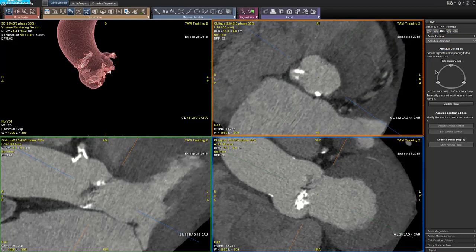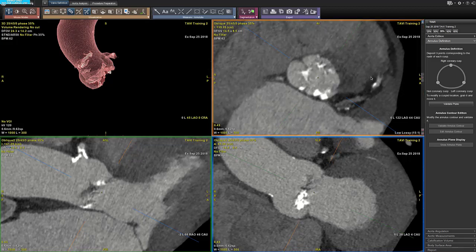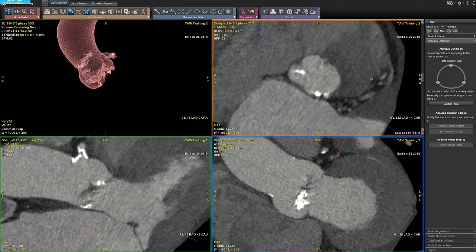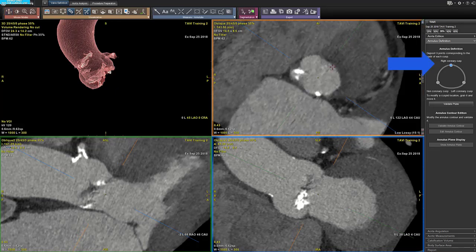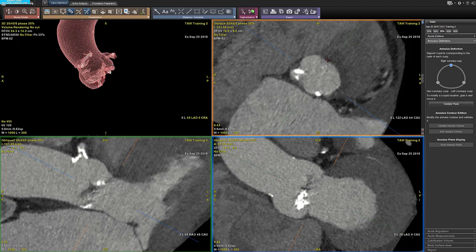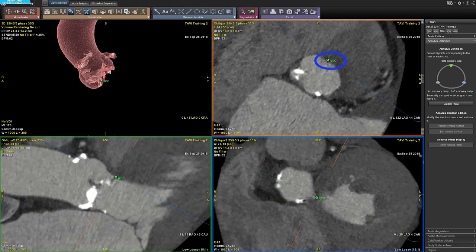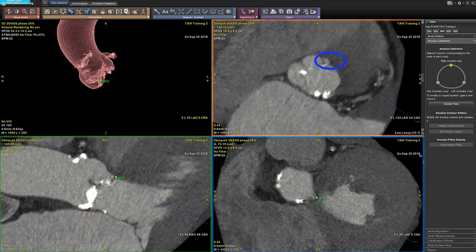The aim of the annulus definition step is to define the annulus of the aortic valve. You need to deposit three points to define the plane. The points need to be deposited at the nadir of each cusp. You select the first point you will deposit, the right coronary cusp, and deposit the point on the right coronary cusp.